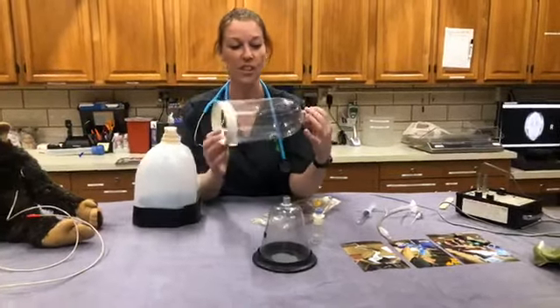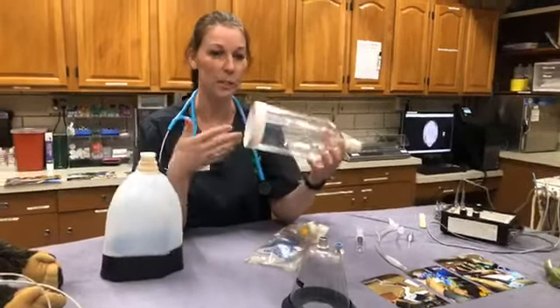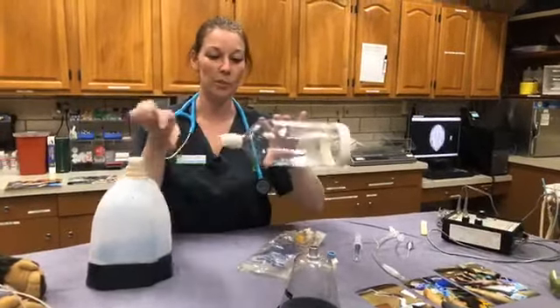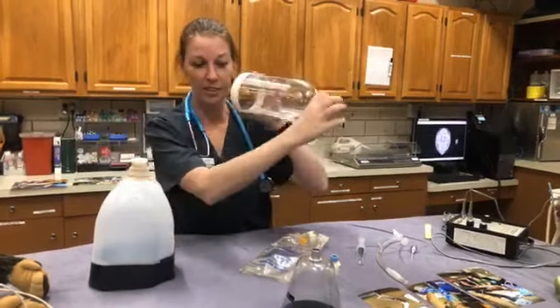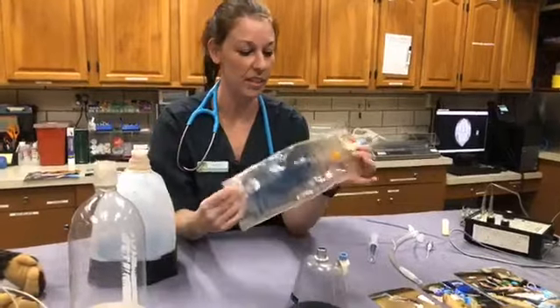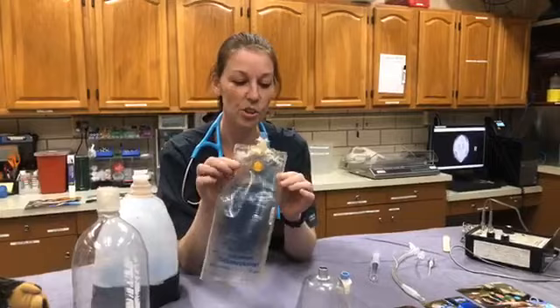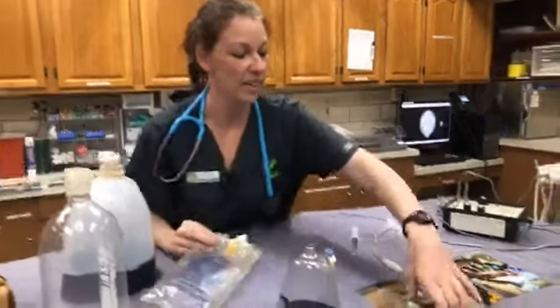So this is just a 2-liter soda bottle that works great for like a long-beaked bird, and you can just hook up your anesthesia tubing here and put it on its little face. And then kind of the same thing with this used IV bag. And so this is really good for storks and flamingos, and I actually have a really cool picture here of it in use with one of our wattled cranes. You can see it just goes over the face, so then they can get the oxygen and the gas, and then they go to sleep.